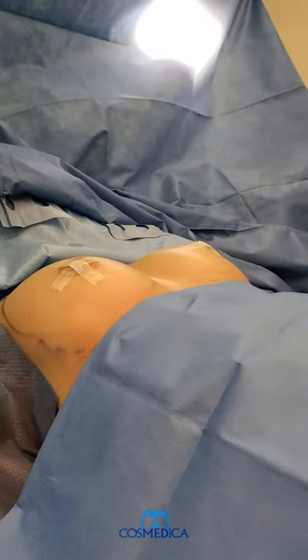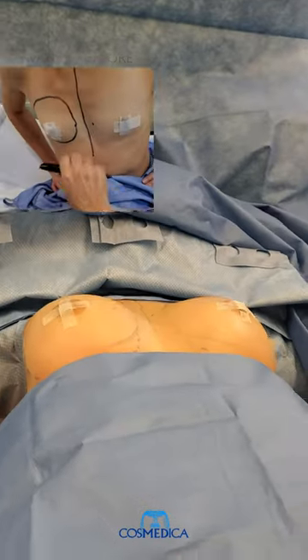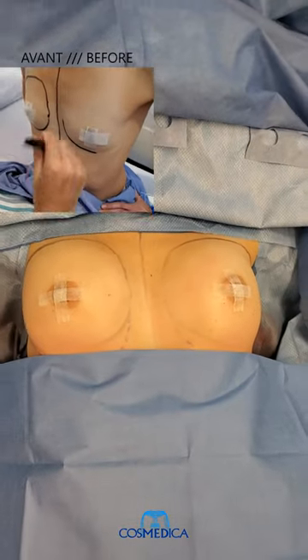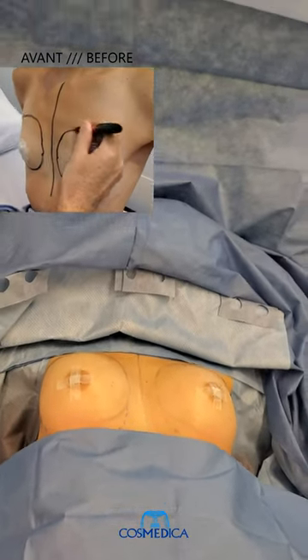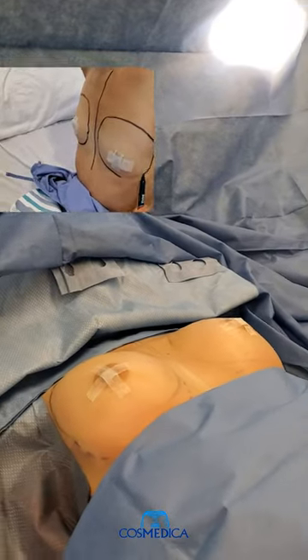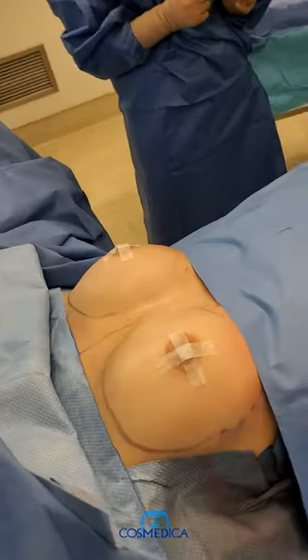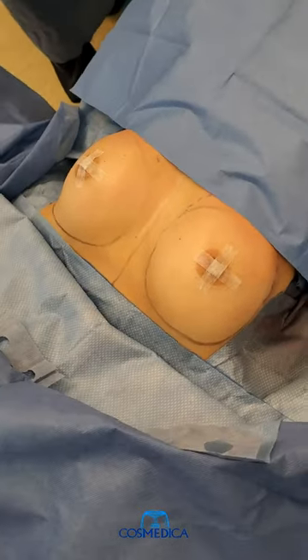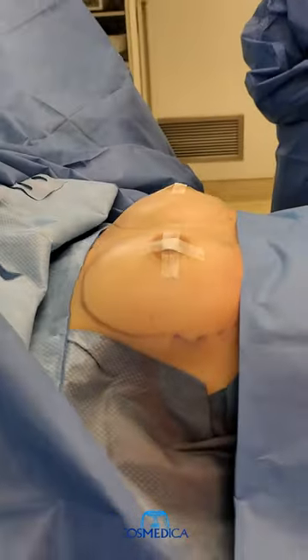We've finished the breast augmentation. We used 240cc gummy bear implants, moderate profile, to give this patient what she wanted — a nice perky B cup from her previous A cup. You can see we have nice symmetry, nice projection, and importantly, the implants fill out the breast width so they look very natural.